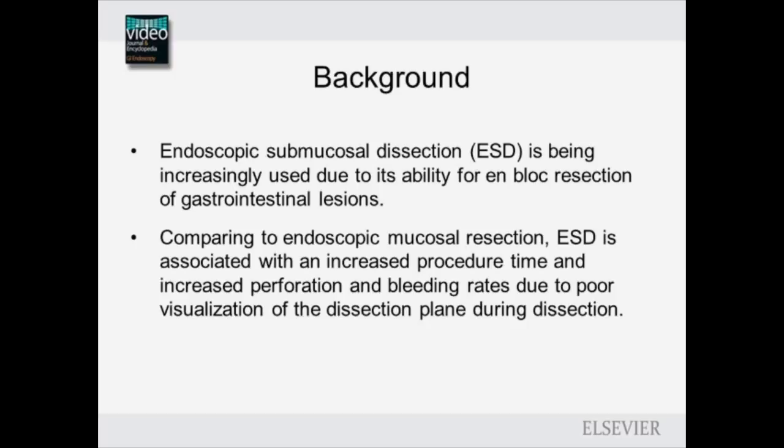Endoscopic submucosal dissection, ESD, is being increasingly used due to its ability for en-bloc resection of gastrointestinal lesions. Comparing to endoscopic mucosal resection, ESD is associated with an increased procedure time and increased perforation and bleeding rates due to poor visualization of the dissection plane during dissection.